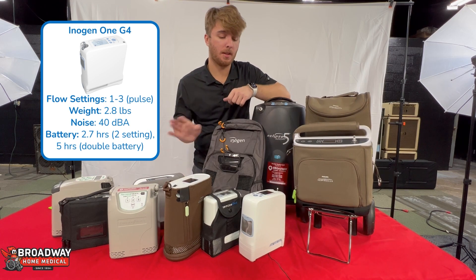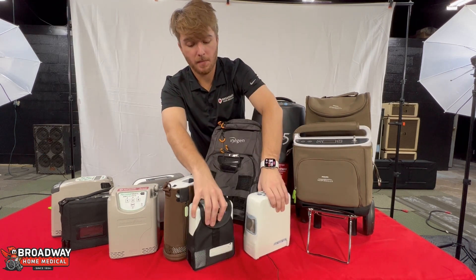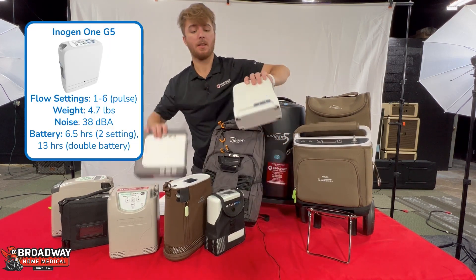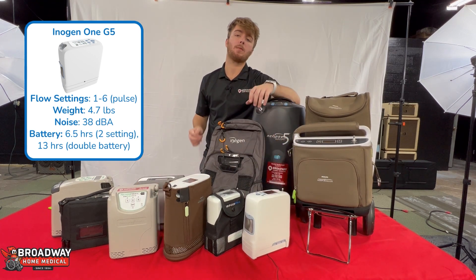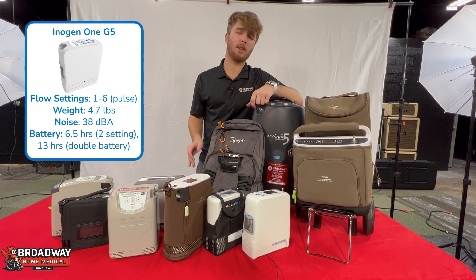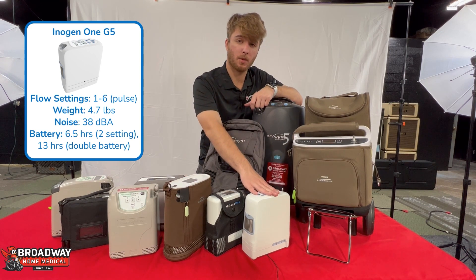Moving on to the Inogen G5. It's bigger and heavier than the G4, but the upside is it's still going to be smaller than most other competitors on the market and it actually has up to a 10-plus hour battery life, which is really outstanding. If you want a machine that's going to be able to last all day without any issues, the G5 is the one you have to go with.